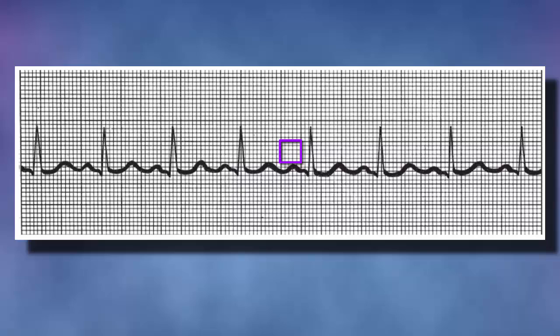And I'll give you the 3 most important things to look at to start off. The first thing you want to do is look at each group of waves for each cardiac cycle and see if there are 3 waves for each. So we're going to start all the way to the left with the first full cardiac cycle, and we're going to find the P wave, QRS, and the T there. So then the next set, 1, 2, 3, and so on. So each cardiac cycle has 3 waves. And so you might have missing waves or you might have extra waves, so you want to take note.